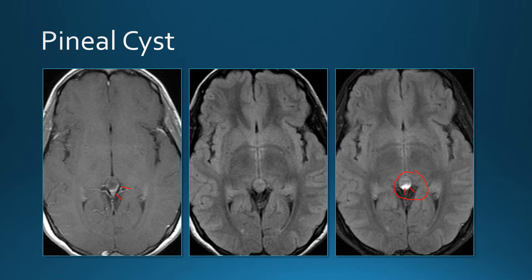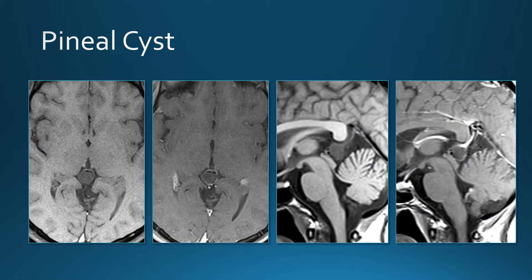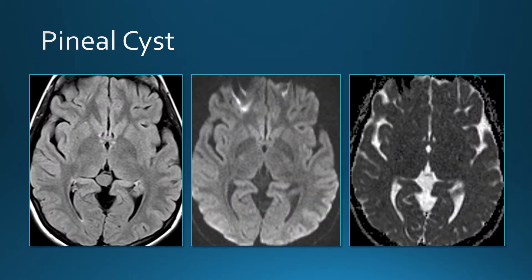Generally it's not enough contrast to make the cyst bright on T1, but it requires very little fluid leaking in to make it bright on post-contrast FLAIR. So sometimes you see enhancement on post-contrast FLAIR but generally not on post-contrast T1. Another pineal cyst — characteristic location, no enhancement. On diffusion-weighted images they're fluid, diffusing similar to water, with very high ADC.